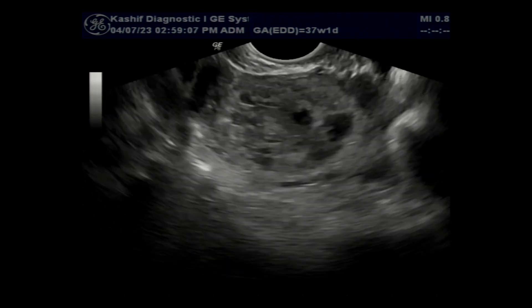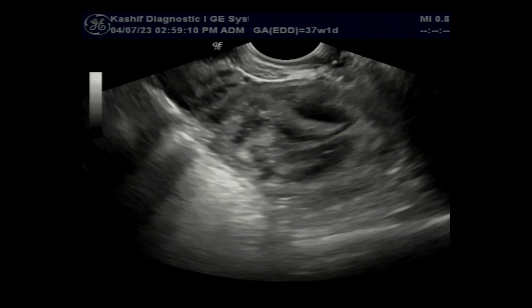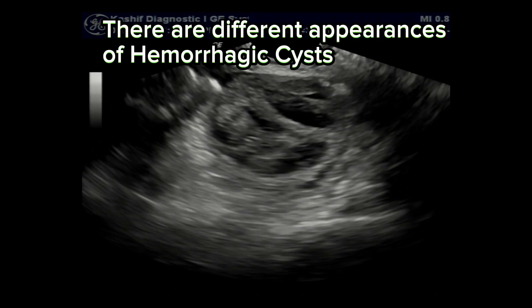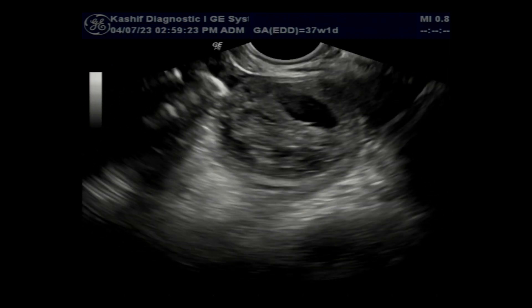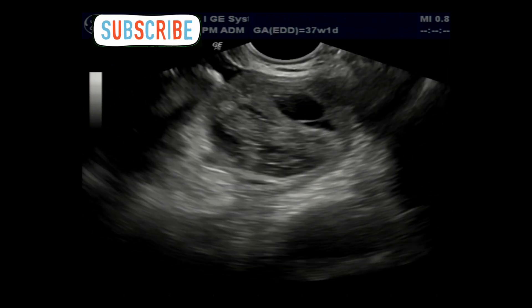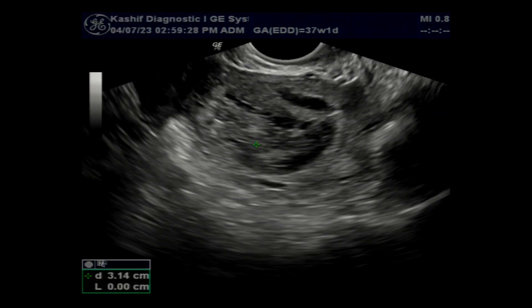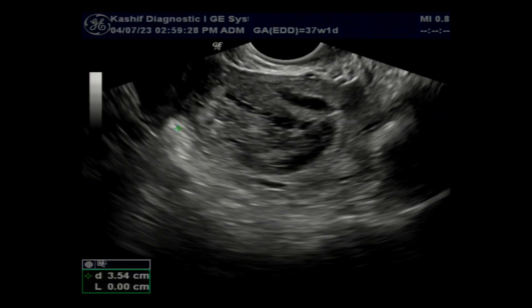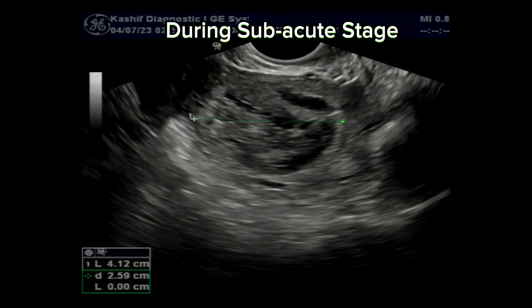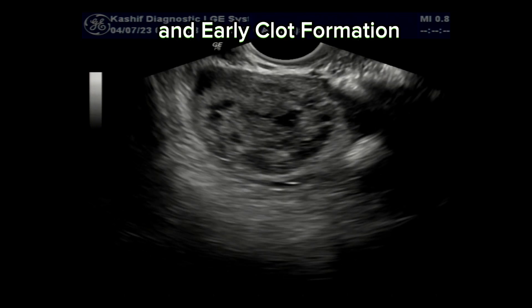However, this is not an ovarian cancer — this is an ovarian hemorrhagic cyst. There are many appearances of ovarian hemorrhagic cysts. This occurs when there is internal bleeding in the cyst. This complex type occurs during the subacute period and early onset of clot formation in the cyst.